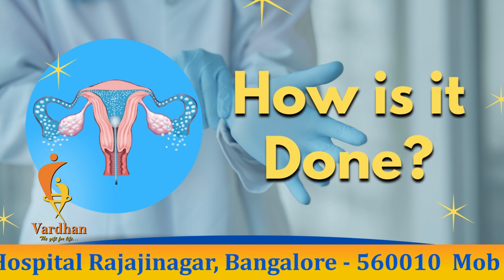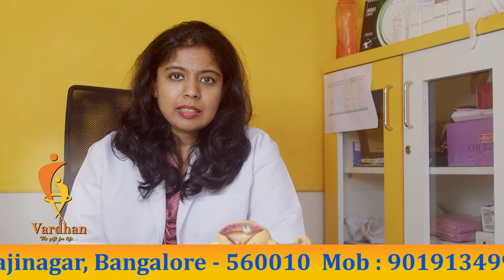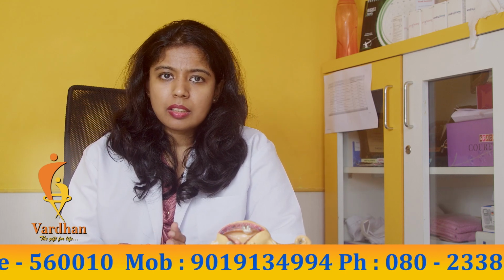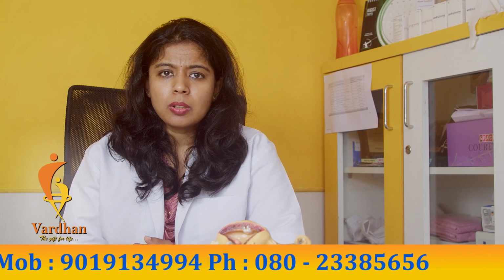How is it done? Like I told you, it is done between 6 to 10 days, and it is done in a setup which has X-ray facilities. For this test, you need not go fasting. You can have some light breakfast or lunch, and you can have food and go.